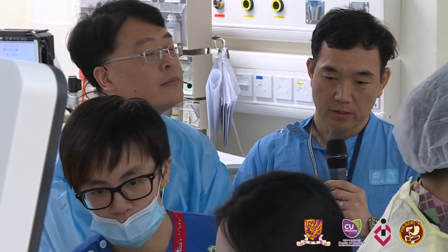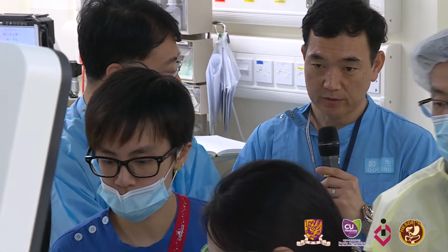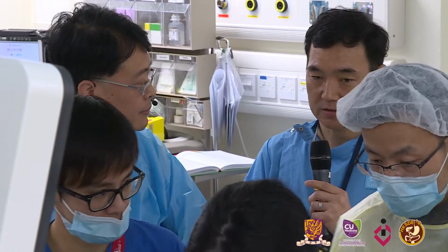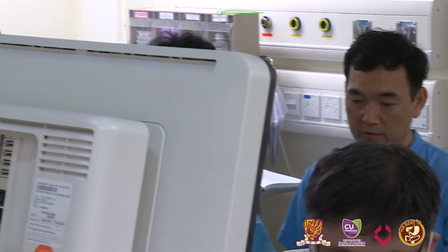So in the stomach, as we discussed yesterday, about 80% is a GIST, but 20% can be a more benign stromal tumor. And 2.6 centimeters doesn't mean that this is going to be a GIST for sure. So probably we tend to perform FNB for these types of lesions. Now, having said that, if you do FNB and then try to do POET or STER, that can cause fibrosis, and creating a pocket can be challenging.